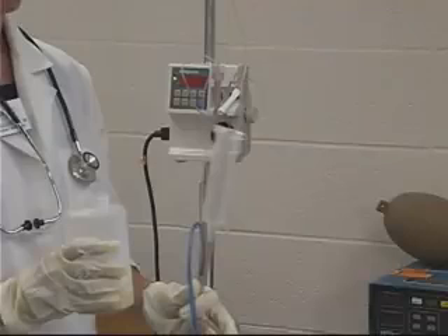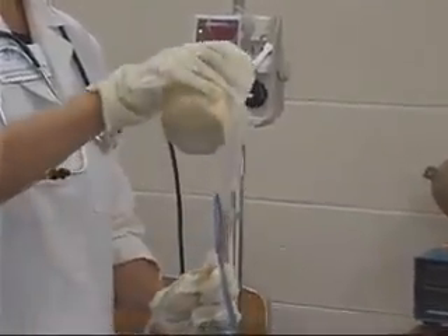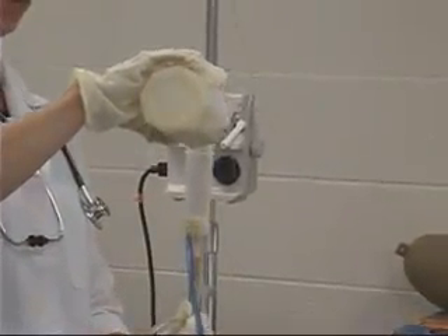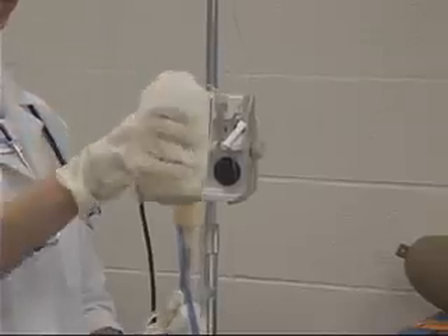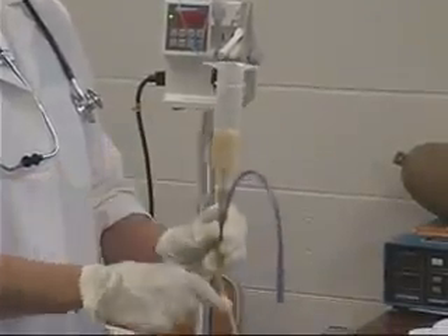Remove the plunger from the syringe and attach the empty syringe barrel to the NG tube. Holding the syringe no higher than 18 inches above the client's stomach, administer 30 cc's of water to flush and test the tubing. Clamp the tubing by folding before the syringe empties, as this prevents administering air into the client's stomach. Pour the feeding product into the syringe barrel and allow it to flow slowly by gravity over 15 minutes. Forced delivery increases risk of cramping, nausea, or vomiting.